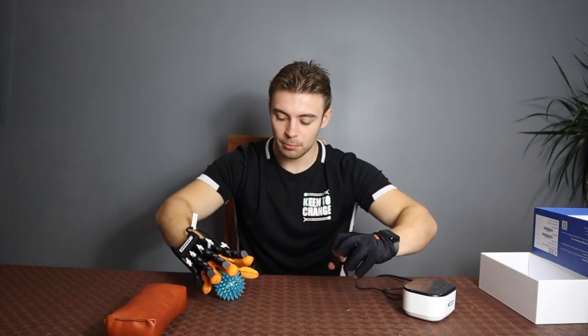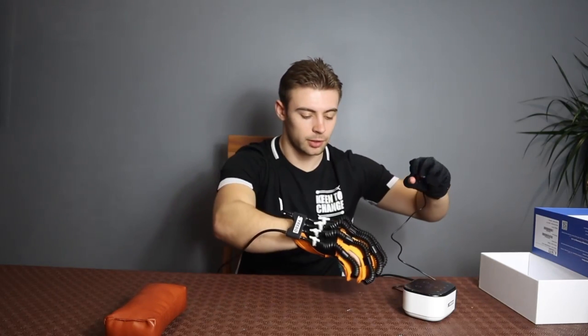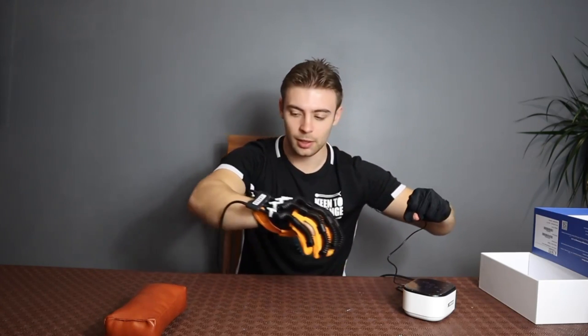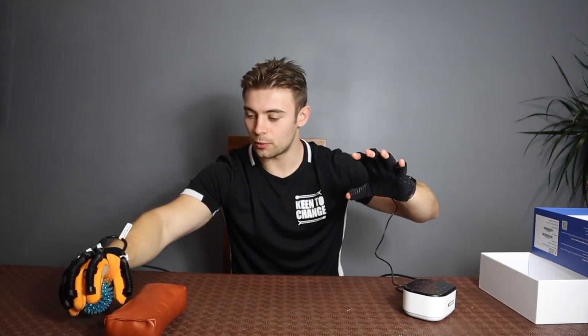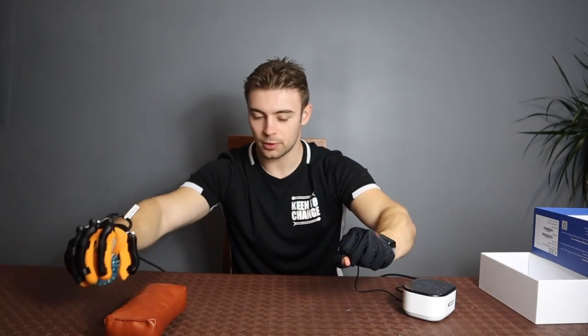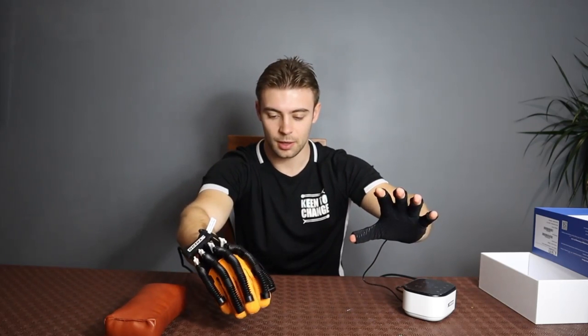What we can actually do is start to train the injured hand. I've got my hand open here and I'm just going to mirror this movement and pick this up and place it over here. As we can see, I'm going to mirror this movement and move it from side to side. Close and open.